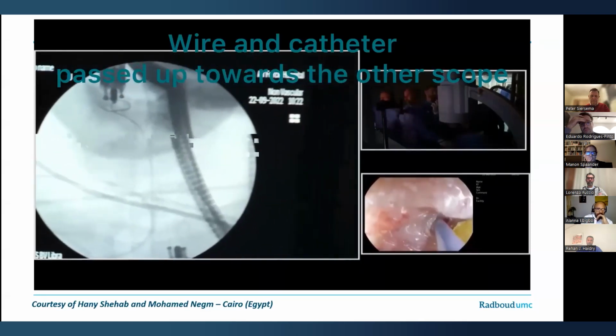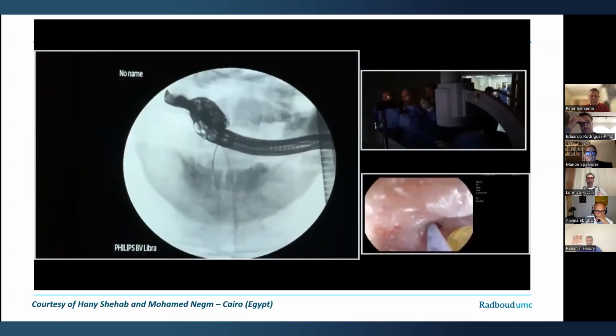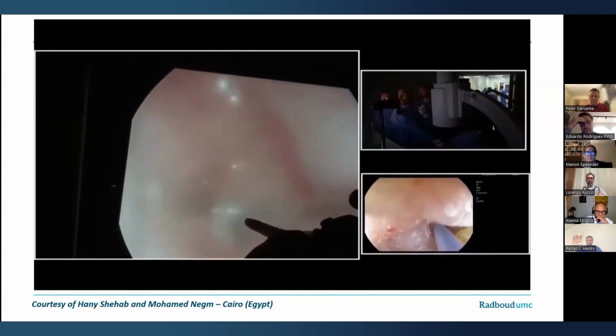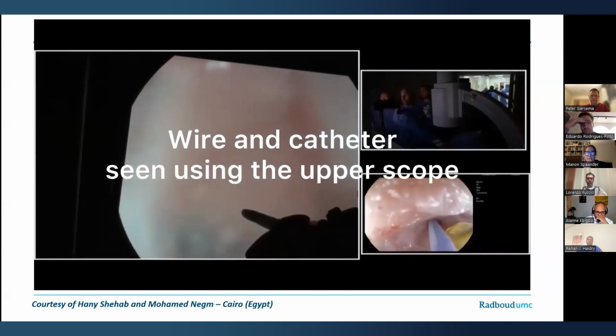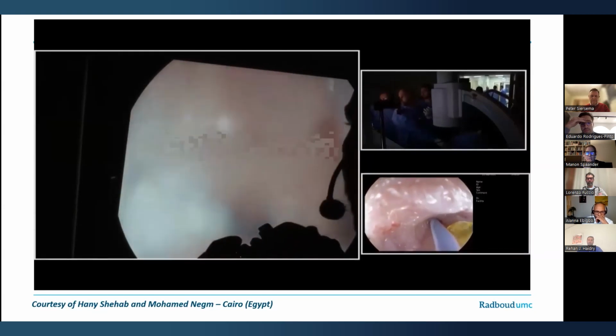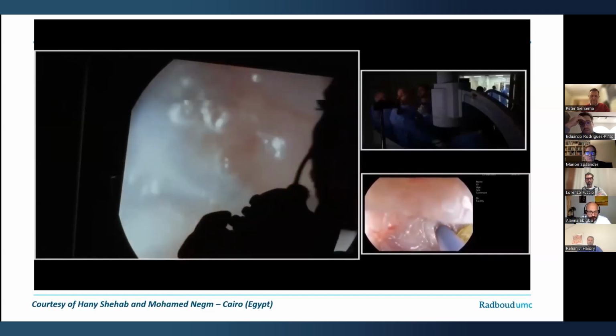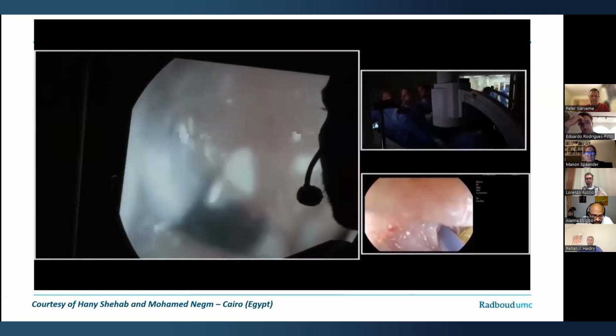Well, I'm a little bit afraid of using dye. Can we get the bronchoscope? Can we get the camera here? Yeah, it's out. Perfect. There we are. Good, fantastic. The catheters come through as well, Peter, now. I think we should hold.